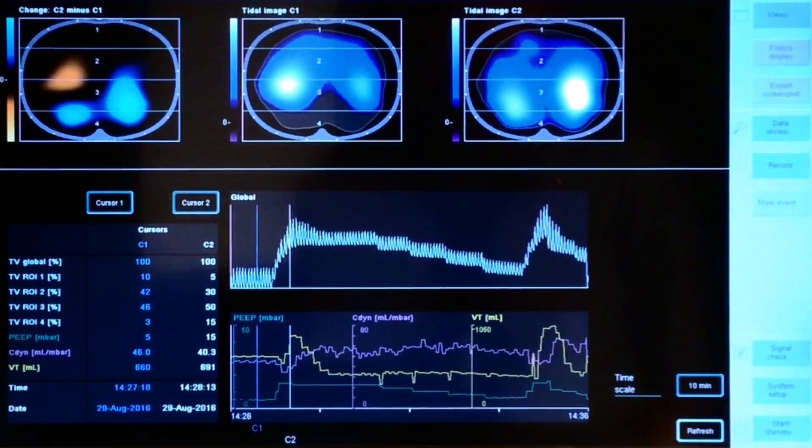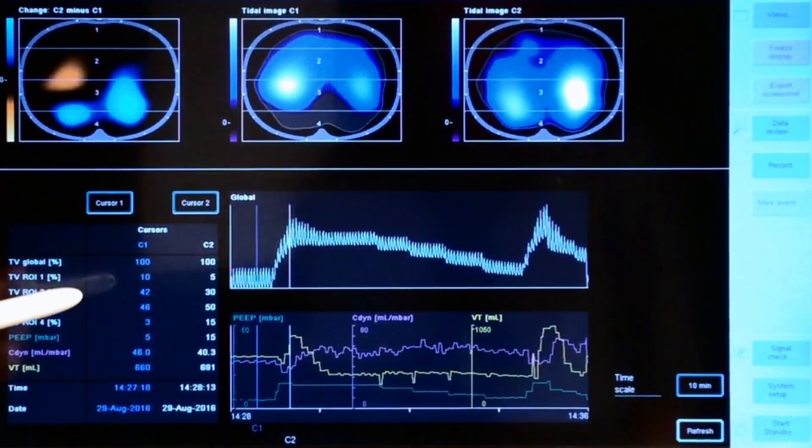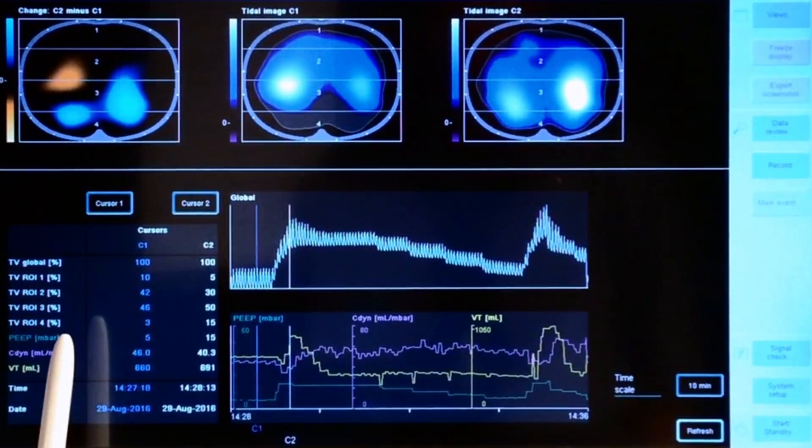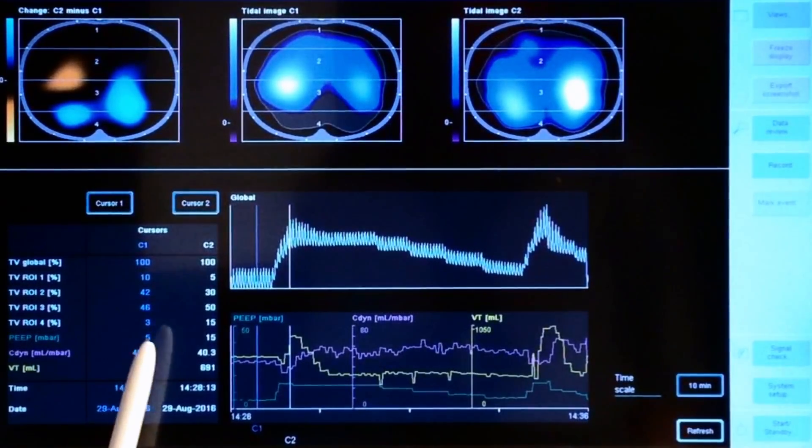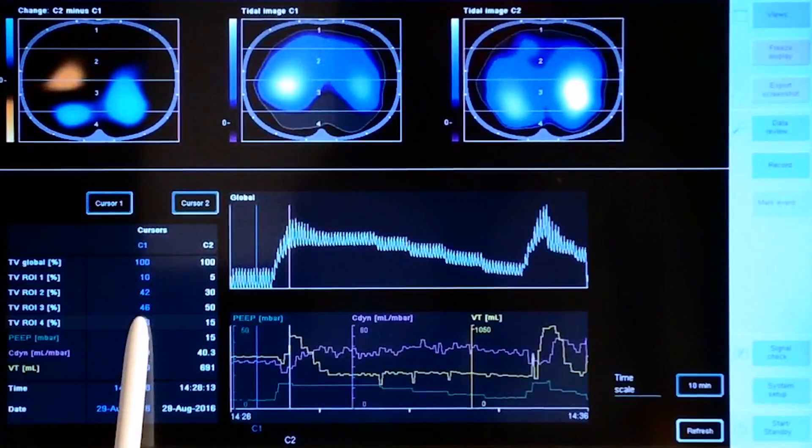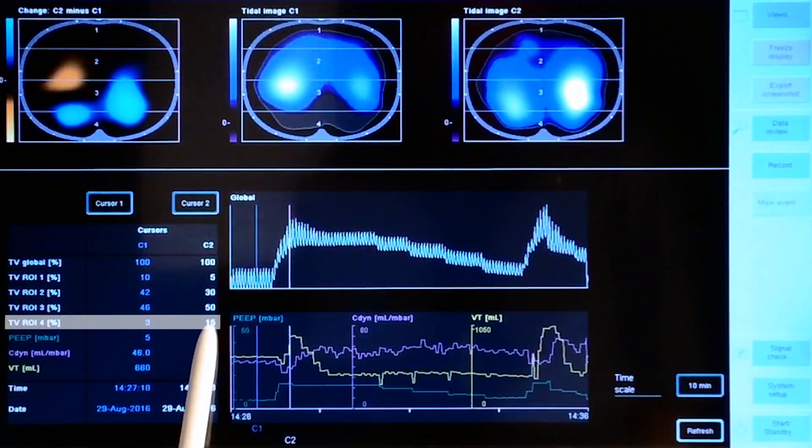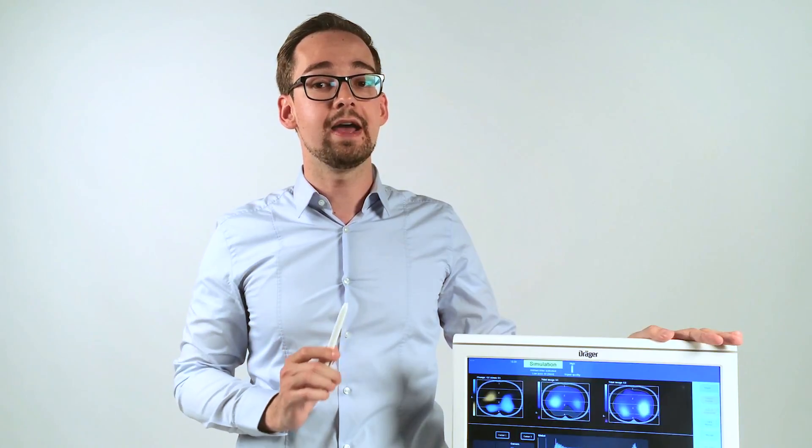You can also quantify how much more ventilation has been delivered into region four by looking at the trend table. In this example, the tidal variation increased from 3% to 15%. With all this information combined, we can clearly see that the patient responded strongly to higher airway pressures.